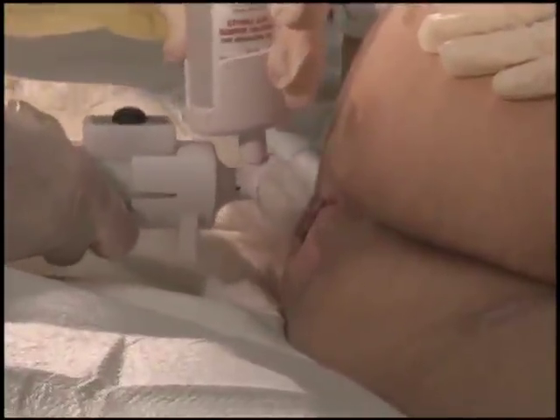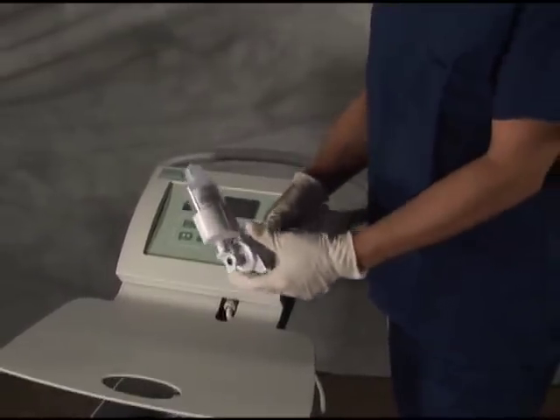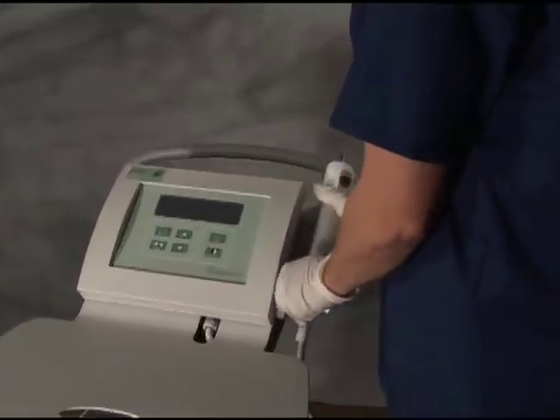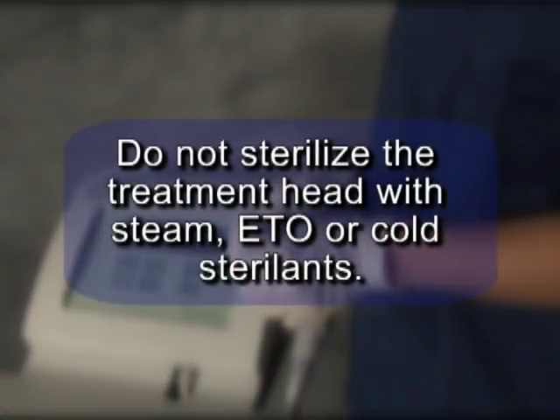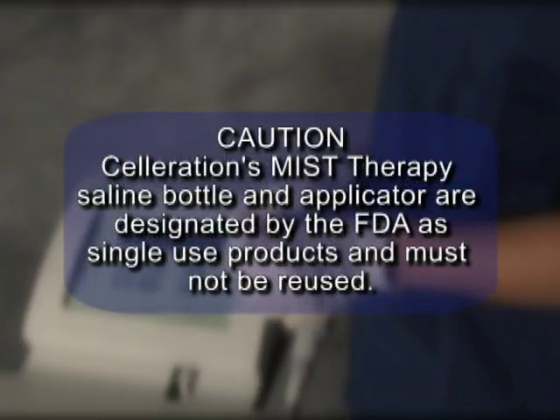When the treatment is complete, rotate the saline bottle in a clockwise direction to stop the flow of saline. Remove the applicator from the treatment head and discard the applicator and saline bottle, which may still contain saline, dependent on the amount required during the procedure. Place the transducer into the transducer cradle. Clean the mist therapy system after each treatment session with the power button in the off position. Do not sterilize the treatment head with steam, ETO, or cold sterilants. Caution: Celeration's mist therapy saline bottle and applicator are designated by the FDA as single-use products and must not be reused.